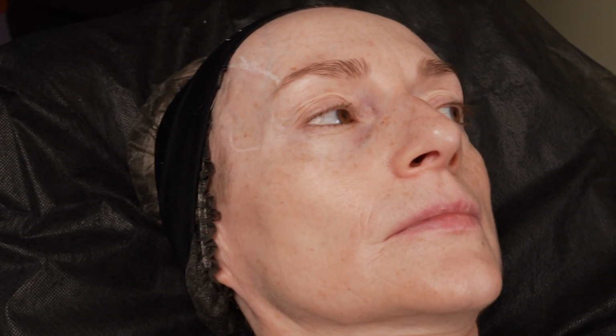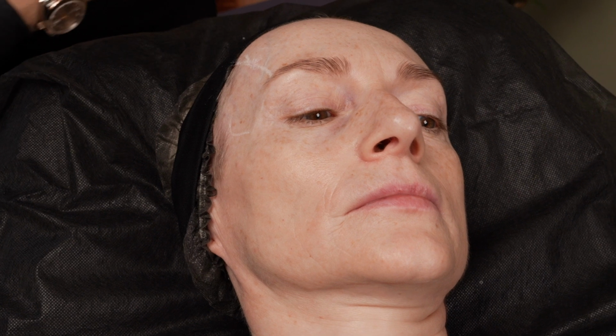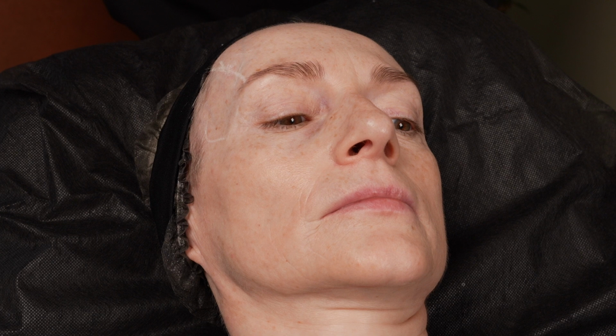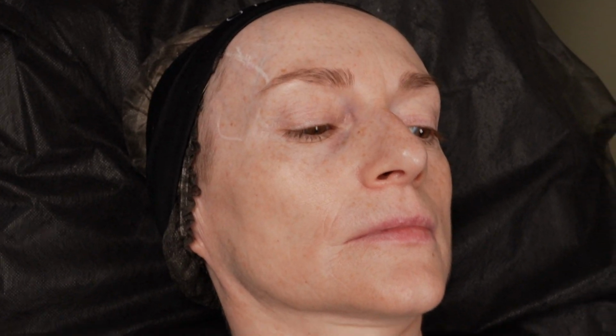For now grade 3. We'll work it through, then it will bend. We probably need 4 and 2. For now 2. RH1, RH4, RH3. I think about 2, yeah? 2 syringes or 3. Yeah, let's see. Okay.